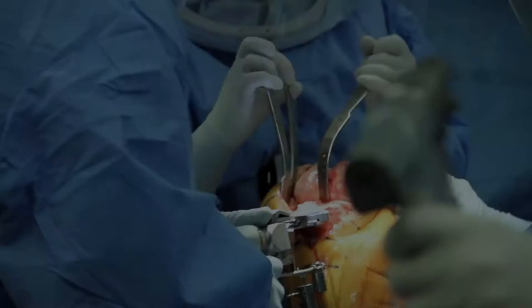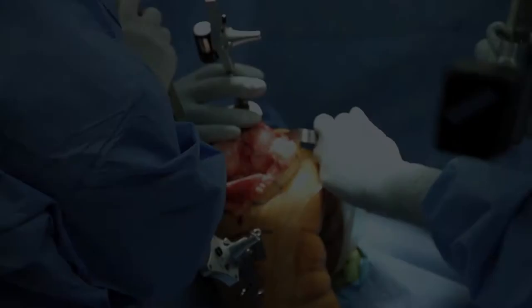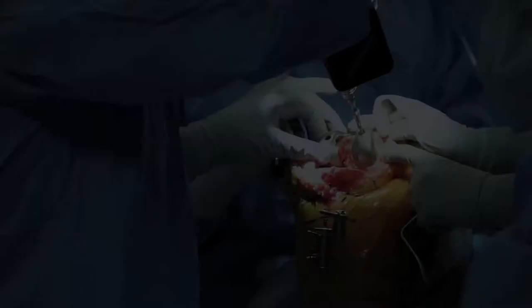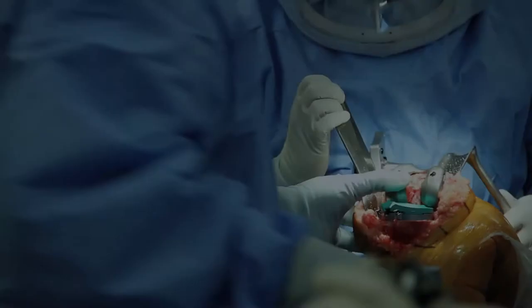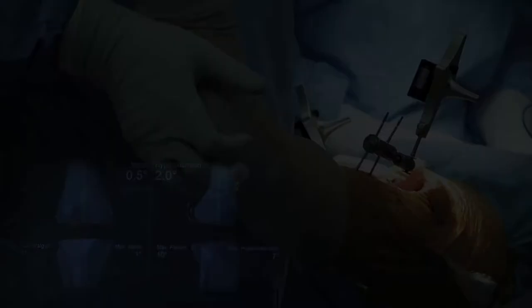A very accurate proximal thin cut is made on the tibia, removing the top of the tibia, cartilage, and a thin layer of bone. The femur is prepared in a similar fashion to the tibia, and then trials are inserted, allowing us to test the kinematics of the joint, making sure that the ligaments are all properly balanced, and any deformity in the leg is being completely corrected by the procedure.